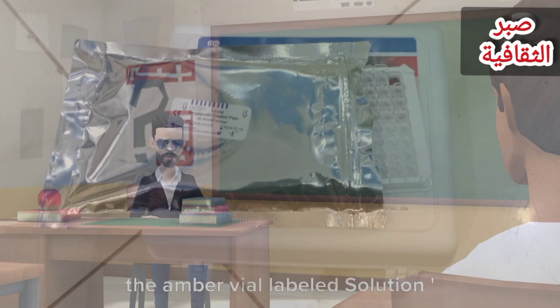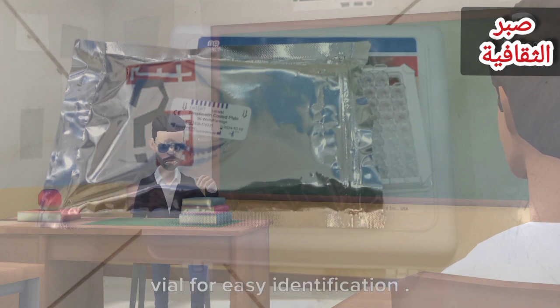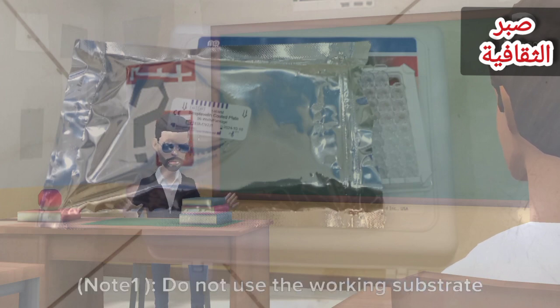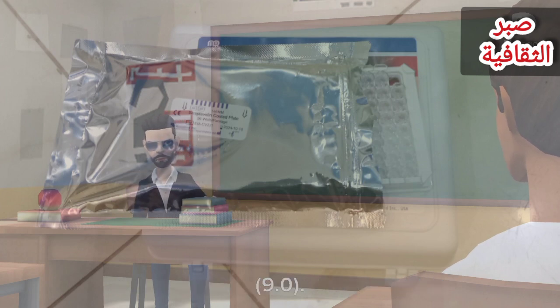Pour the contents of the amber vial labeled solution A into the clear vial labeled solution B. Place the yellow cap on the clear vial for easy identification. Mix and label accordingly. Store at 2-8 degrees C. Note 1. Do not use the working substrate if it looks blue. Note 2. Do not use reagents that are contaminated or have bacteria growth.